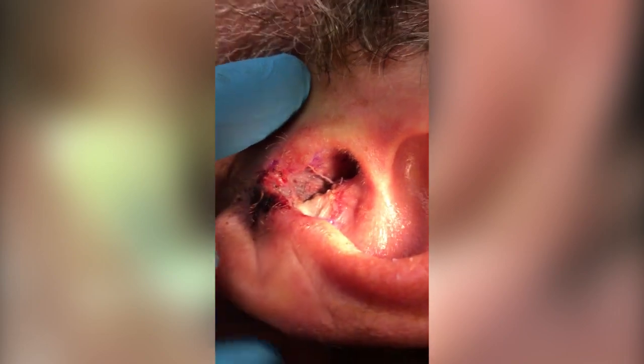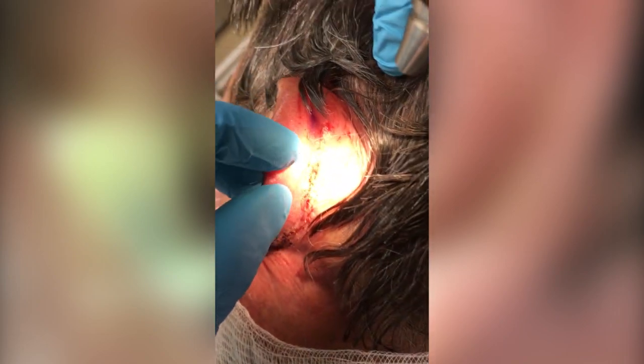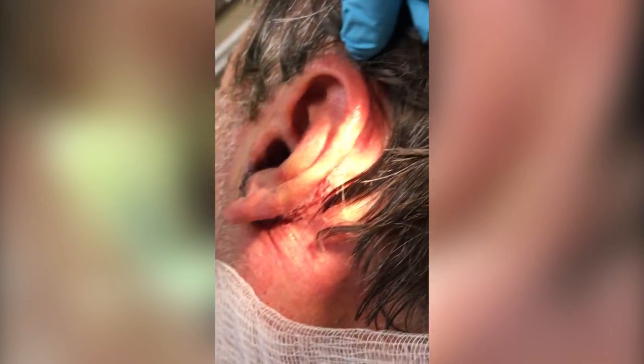Excellent, fantastic. And let's look at the donor side — that's healing very well. All absorbable sutures. We'll clean it up and we're good.